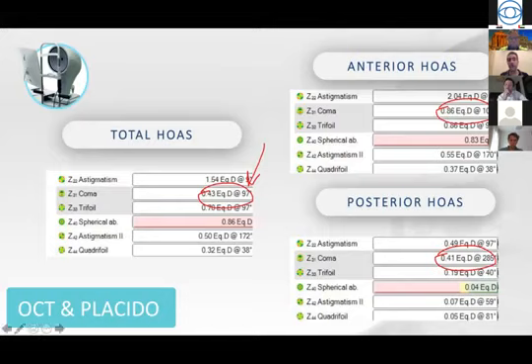Now, if we do regular topography-guided or anterior corneal wavefront-guided treatment, that's what we're going to treat, 0.86. But if we do that, that's going to expose the 0.41 here, and then we're going to end up with 0.41 exactly where we started. So that's crazy. I would not do that. And that's how you could locate it with the OCT-based tomography.